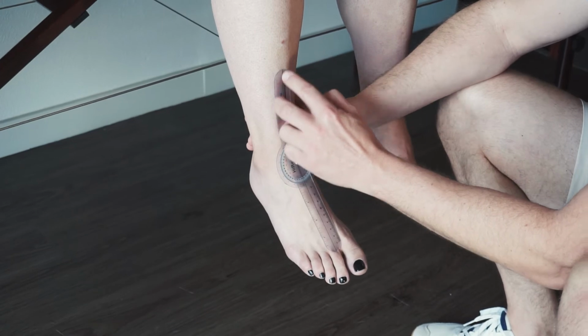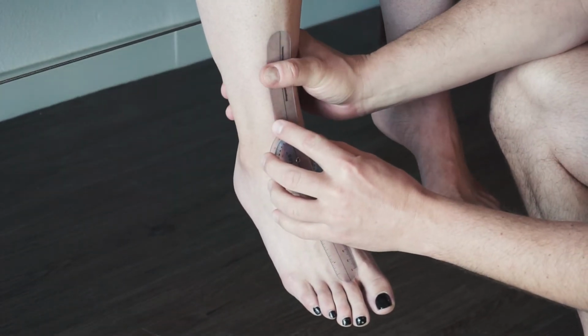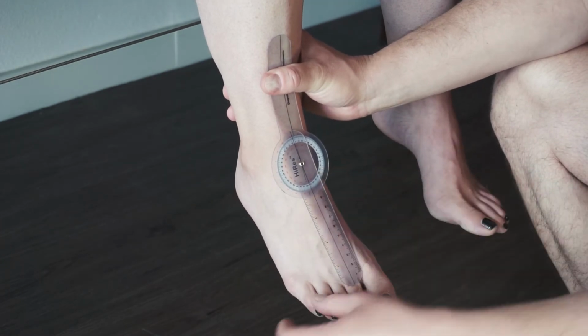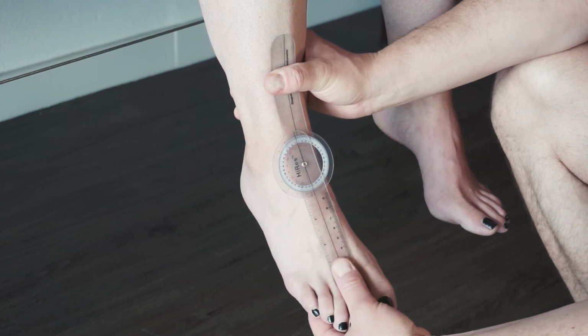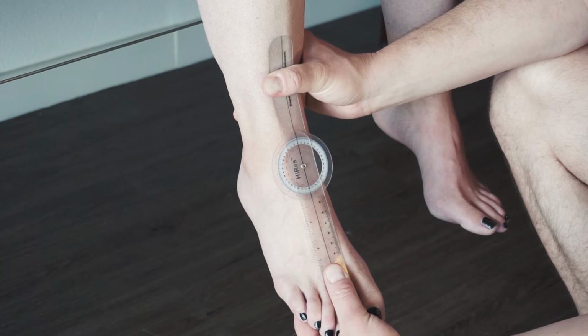The proximal arm is going to follow the tibia up to the tibial tuberosity. And then the distal arm, or moving arm, is going to follow that second metatarsal. Okay, it's going to be parallel to that. Now, we're going to start at 0, so it's like it's a straight line.